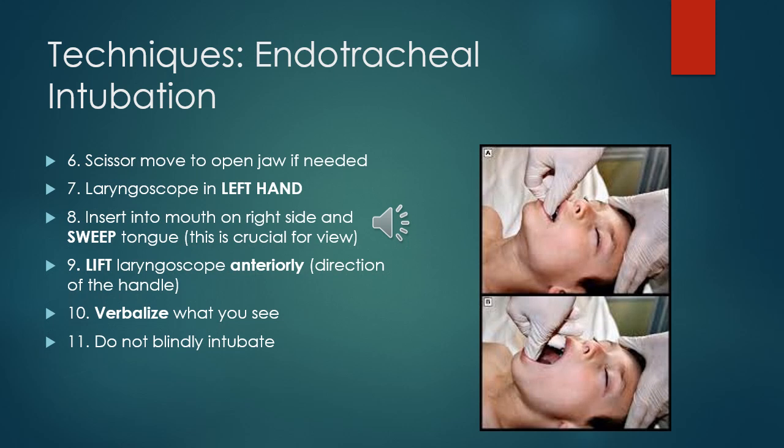The point that I'd like to emphasize here is to be sure to verbalize what you are seeing. It will help decrease the heart rate of whoever is with you, and they may be able to offer more assistance if they know what you're seeing. And then at this stage, do not blindly intubate. Make sure that you have a clear target before proceeding with trying to intubate.